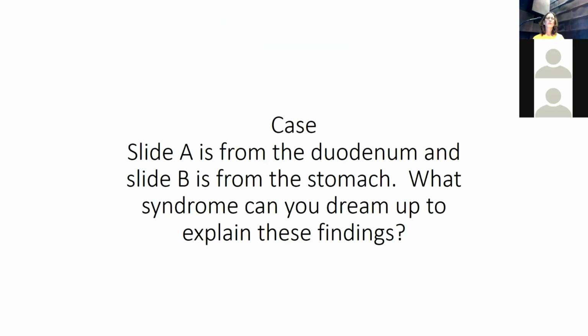Okay, let's look at another case. This one's for the residents. You'll need this for your exams, but the rest of us encounter it once in a while. Slide A is from the duodenum and B is from the stomach. What syndrome can we think of?